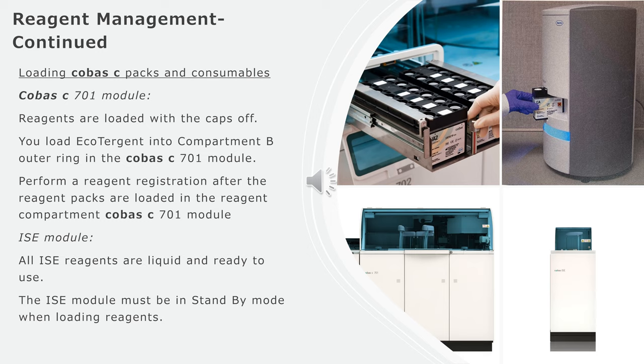Loading Cobas C packs and consumables: For Cobas C701 module, all reagents are loaded with the caps off. Remember, you load detergent into compartment B outer ring in the Cobas C701 module. Perform reagent registration after the reagent packs are loaded in the reagent compartment Cobas C701 module.